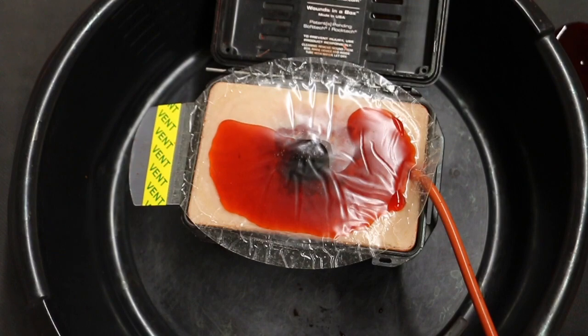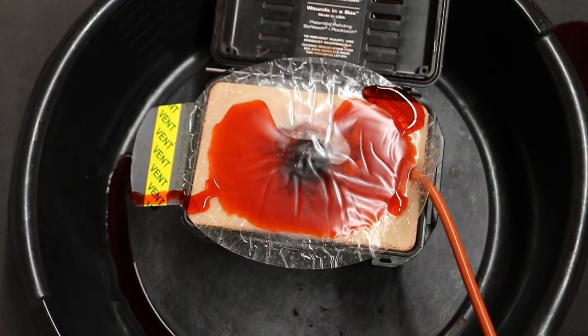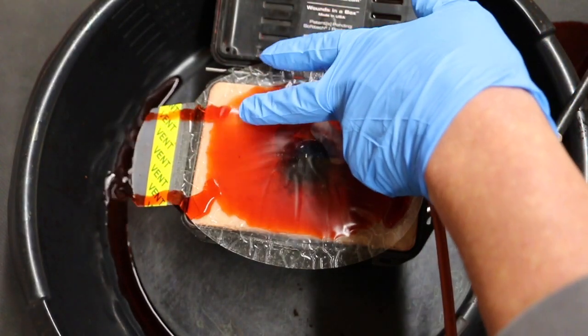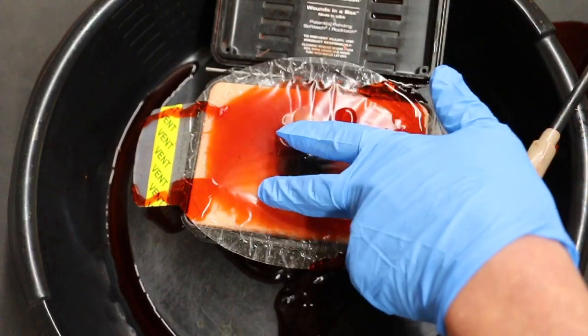Okay, and now you can see it's going to start moving towards the vent. You can see it come out the vent holes here and the vent holes here. See if I can get it to come out the other vents. See, it's starting to come out this, there you go. Come out that vent, so we are coming out all the vents.